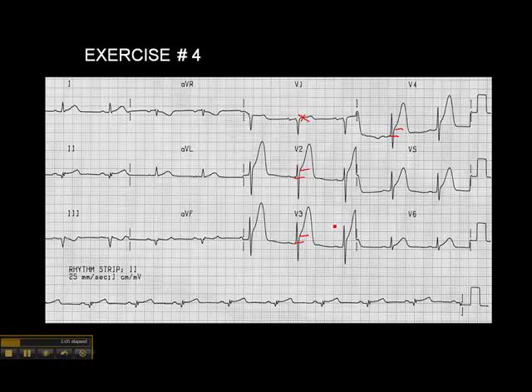So we know we have an anterior wall MI. We can't say anteroseptal because we really can't — I wouldn't say there's ST elevation in V1, but it's kind of academic anyway. Anterior wall MI, we know we have that.